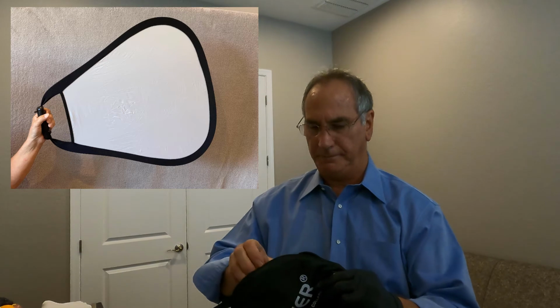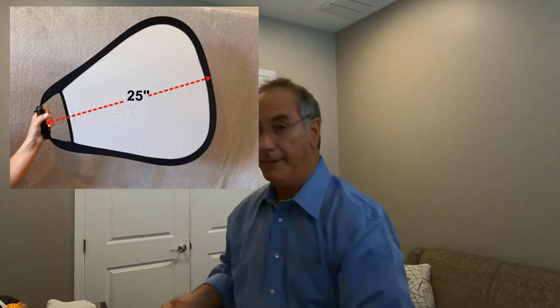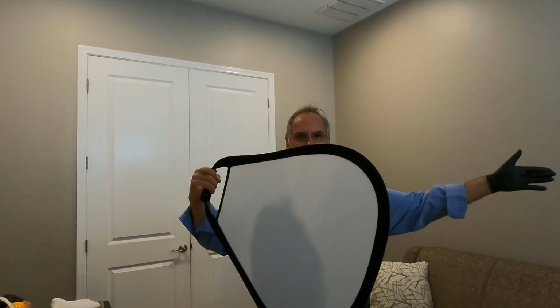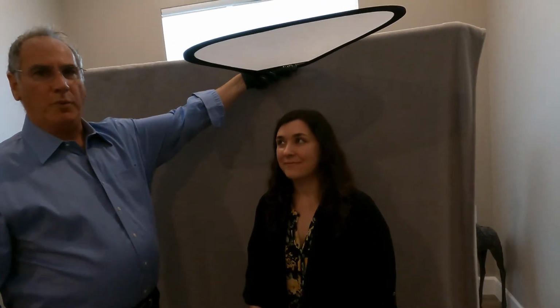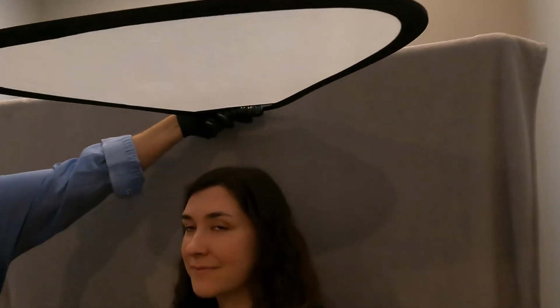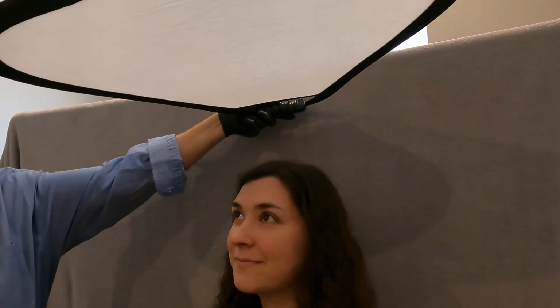For those of you that can't turn your ceiling lights off, we have a great product. This is from Newer. It's a diffuser. And let's open that up. You have to be careful because it kind of explodes. Now, you have your assistant simply hold this over the patient's head. It diffuses the ceiling lights, and it won't put glare on your shade tab. So that's something that you can do, again, if you can't turn your ceiling lights off.